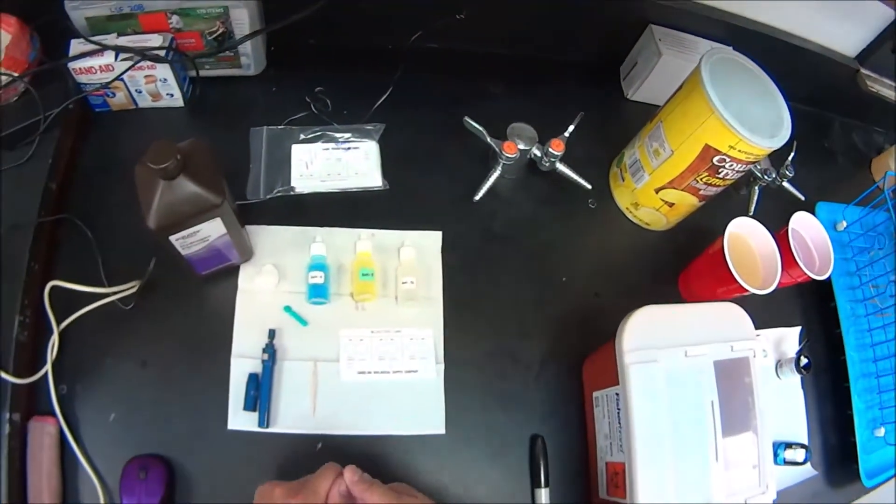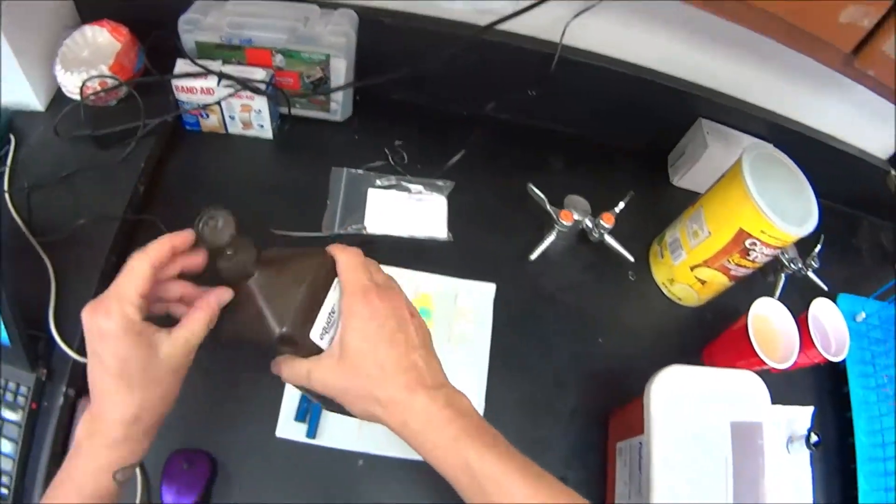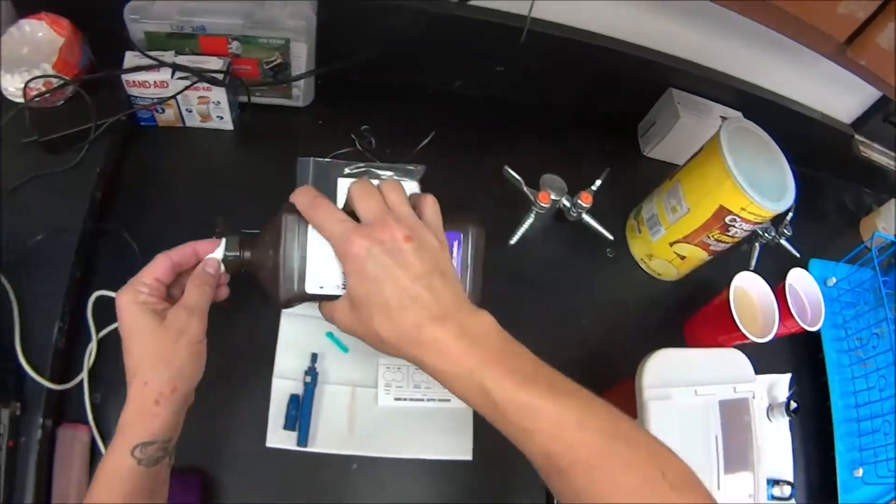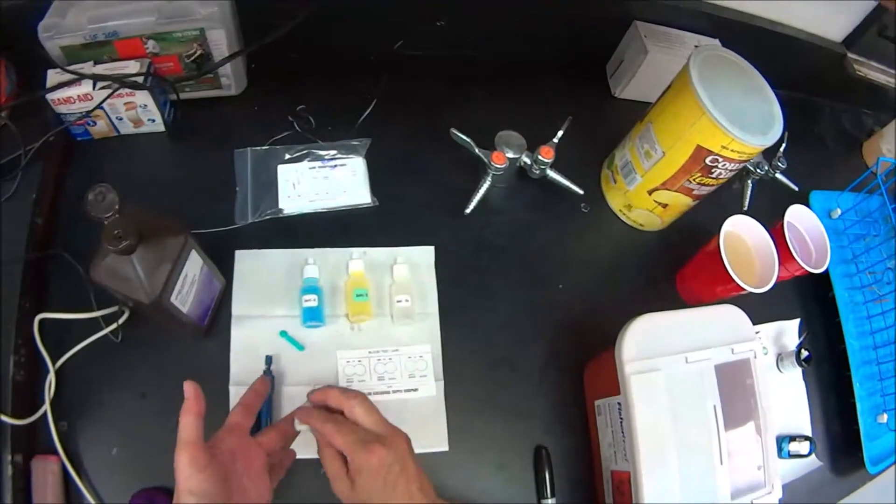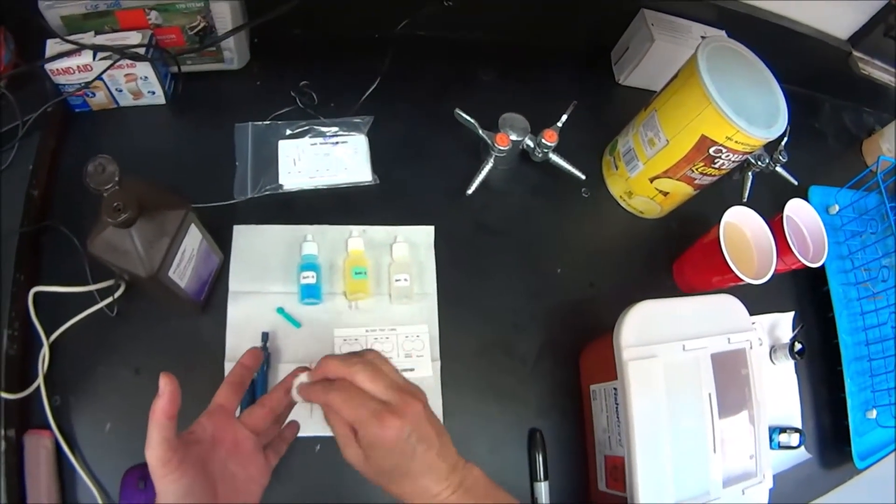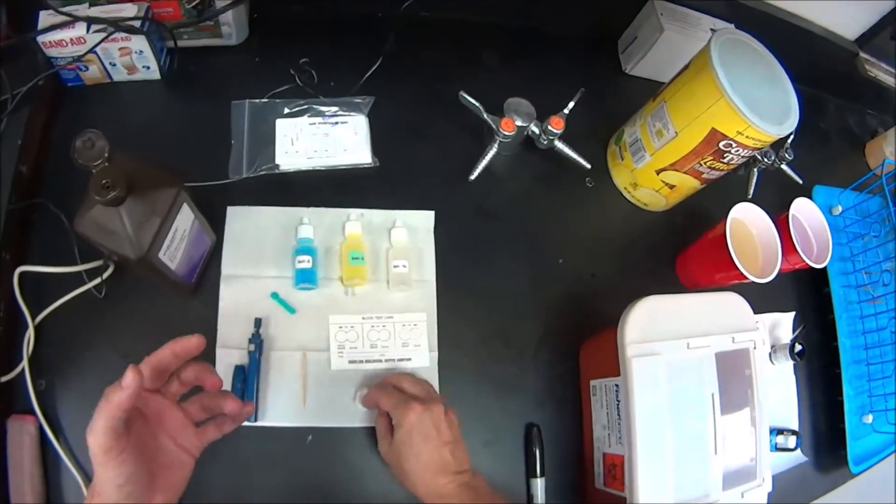Okay, so let's get started by cleaning our finger first. Alright, that's clean, ready to go.